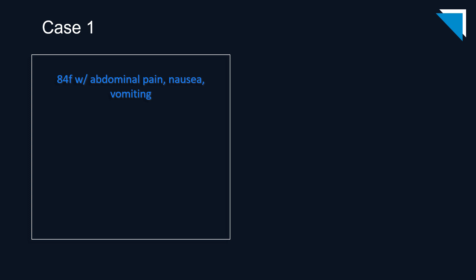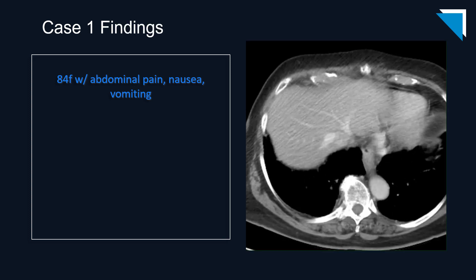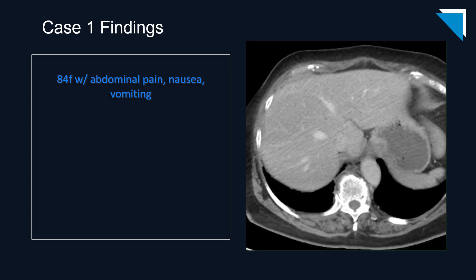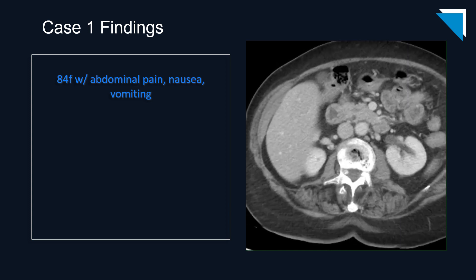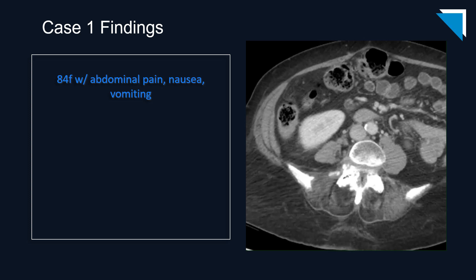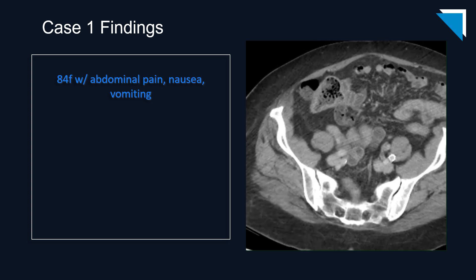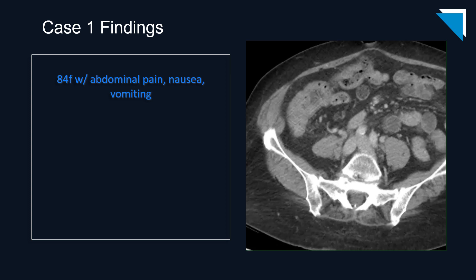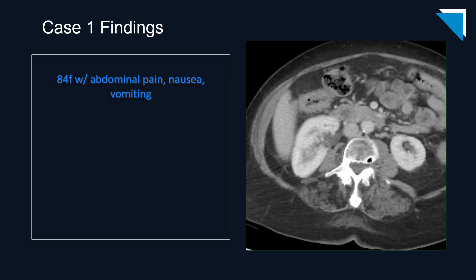Our first patient is an 84-year-old woman with abdominal pain, nausea, and vomiting. These are axial images from a CT scan of the abdomen and pelvis. Of course, if you were reading this in real time you would be scrolling up and down the various sections as you engage your search pattern. For the purposes of this lecture, I will scroll down and then back up so you can see all the relevant pathology.